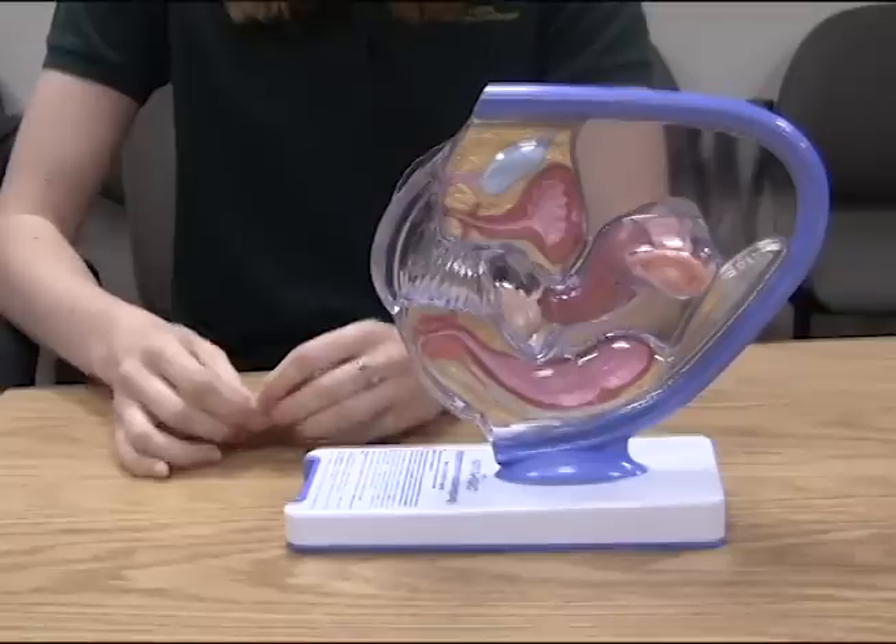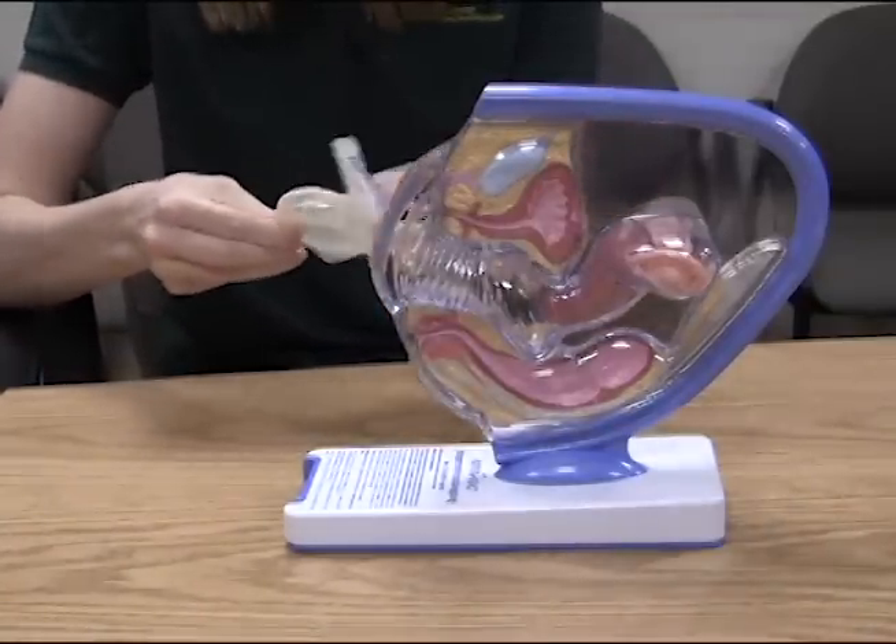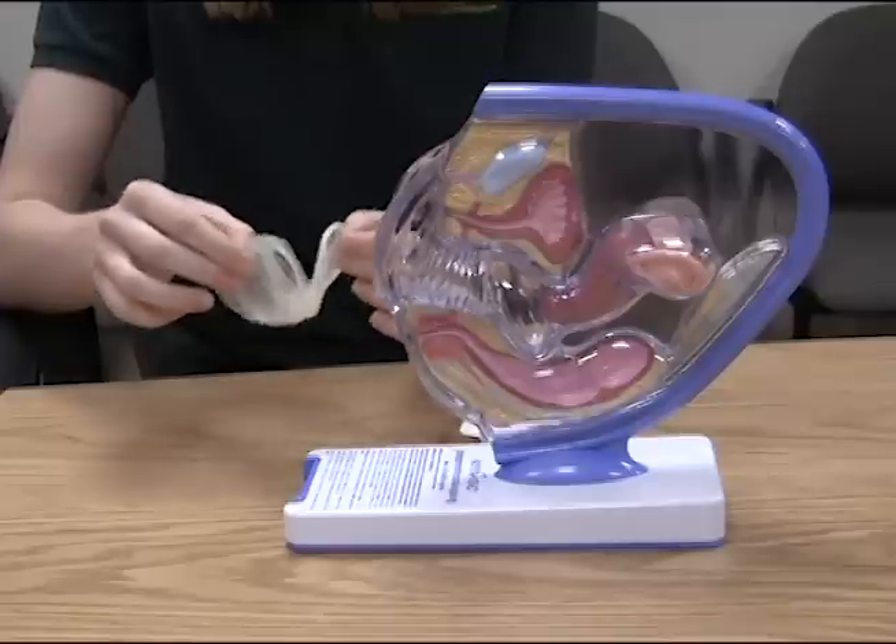If the seal is broken, then you want to dispose of the current condom and grab a new one. When you open the female condom, take it out, and there are two rings with the female condom.